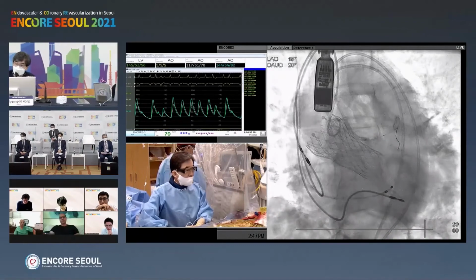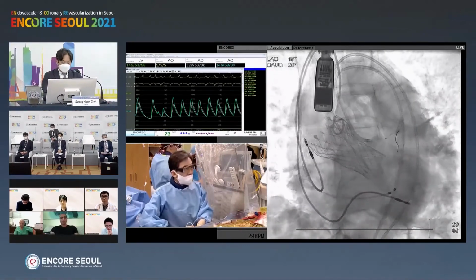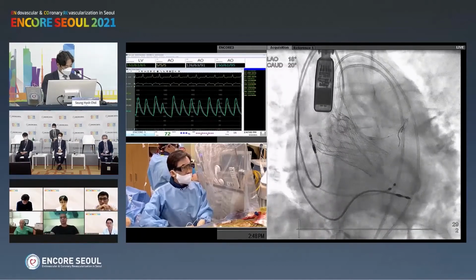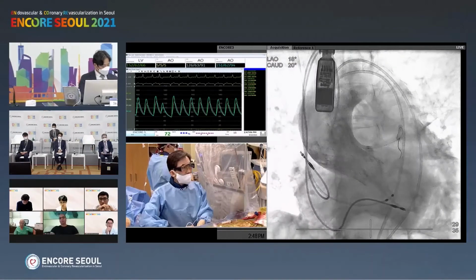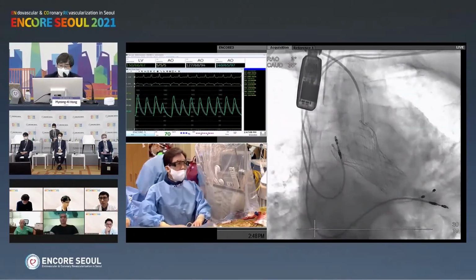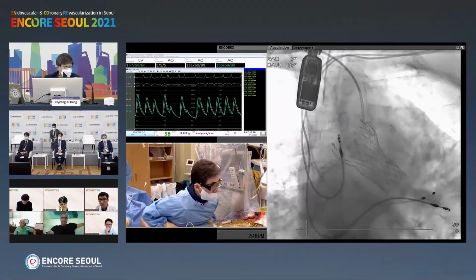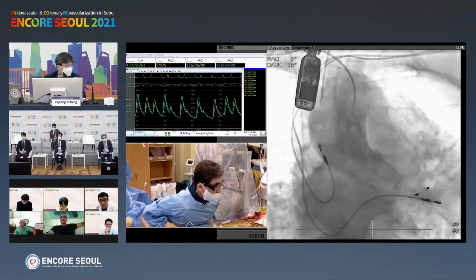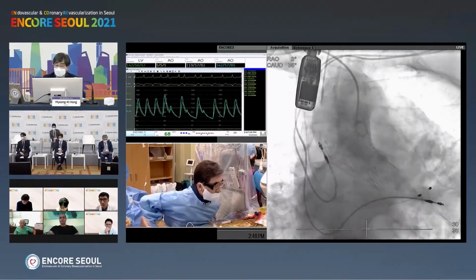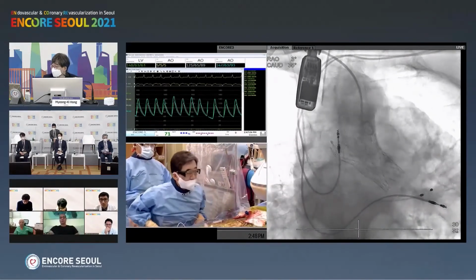In this view, the important point is that angiographic interpretation is very, very difficult and variable. So at the time we do the TEE and then try to find what is the functional problem. If there is no limitation of the mitral valve, that's it. How about the impression of this case, Dr. Finkelstein or Sate?